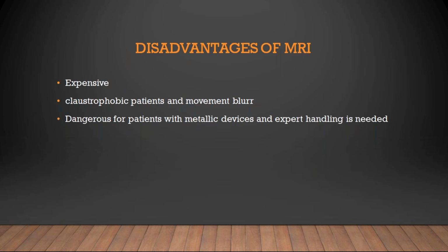What are the disadvantages of MRI? MRI is an expensive machine, and it should be handled very carefully, and expert handling is needed for radio frequency coils, etc. Claustrophobic patients, who are afraid of closed spaces, are difficult to image, and the patient needs to stay still for about 15 minutes to obtain sections of the desired part. So any kind of movement blur can cause artifacts in the images. It is very dangerous for patients with metallic devices.